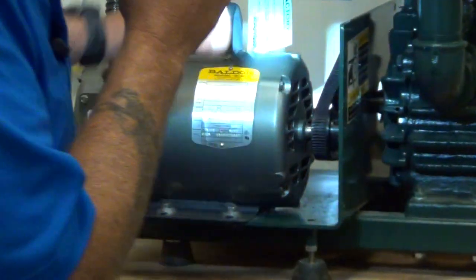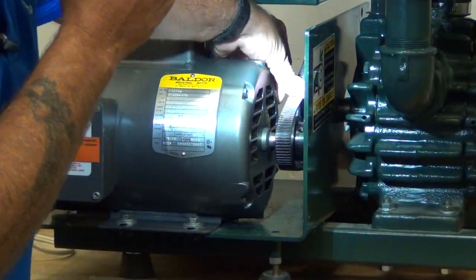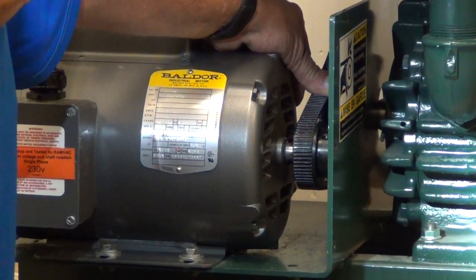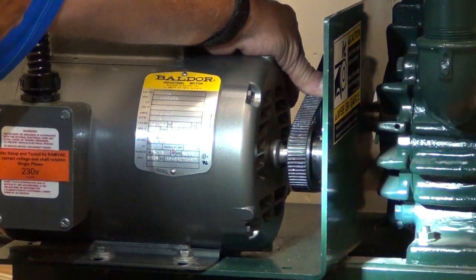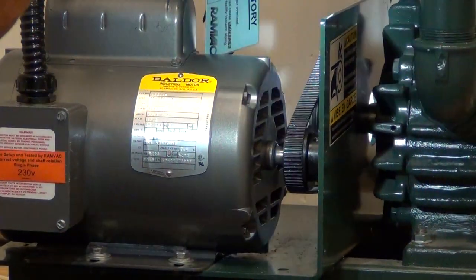Now we're going to check belt tension. Put your thumb down — if you can depress more than a half inch, the belt is too loose. We'll go into the belt adjustment procedure on the technical video. The belt's good. It looks good. That looks fine.